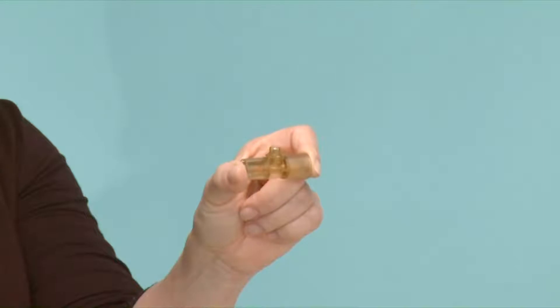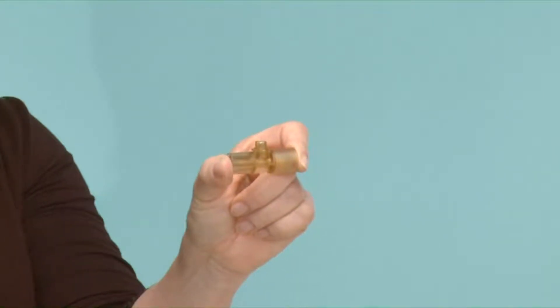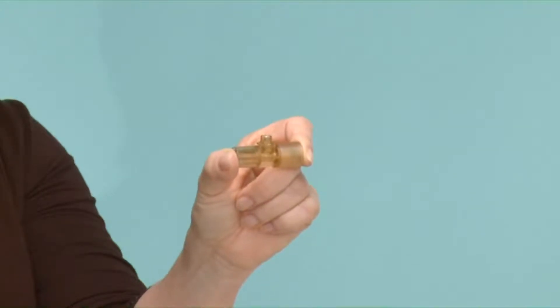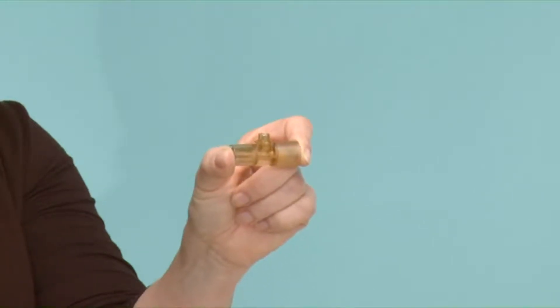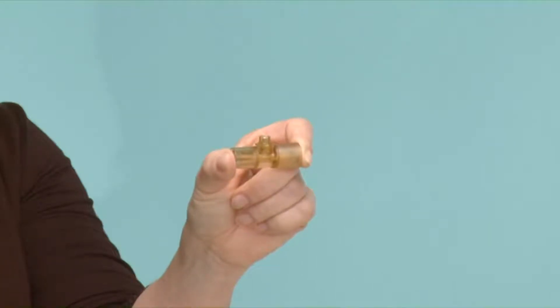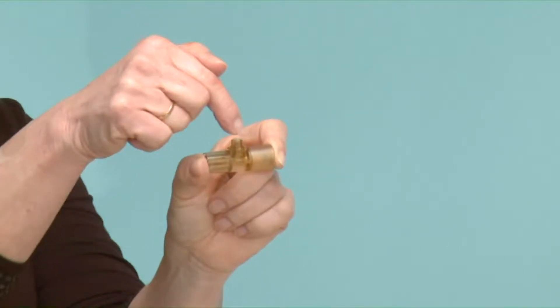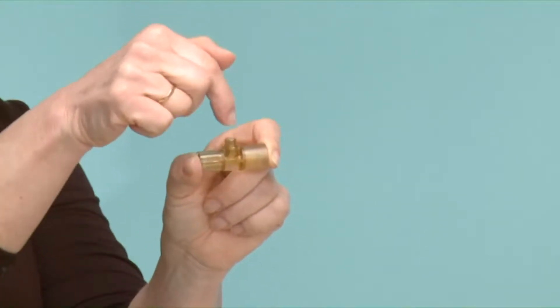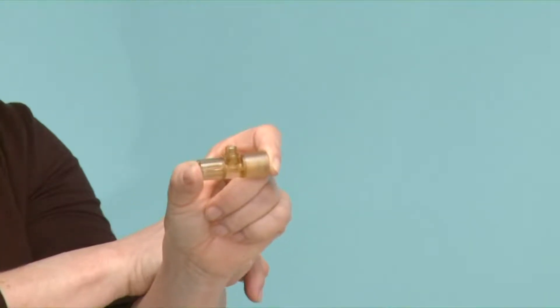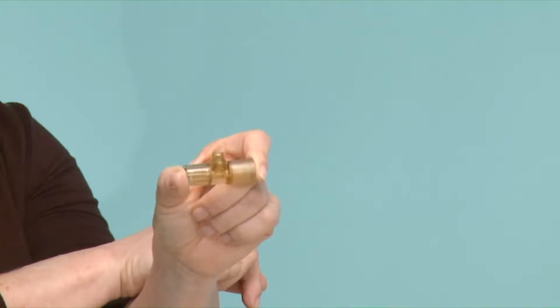Once the infant has been weaned from the ventilator, you need to think about the various components that need cleaning and sterilizing. The most important one is the flow sensor. In the middle are heated wires which reach incredibly high temperatures, and if there have been secretions at any time during ventilation, that heat is enough to bake the secretions onto the wires.